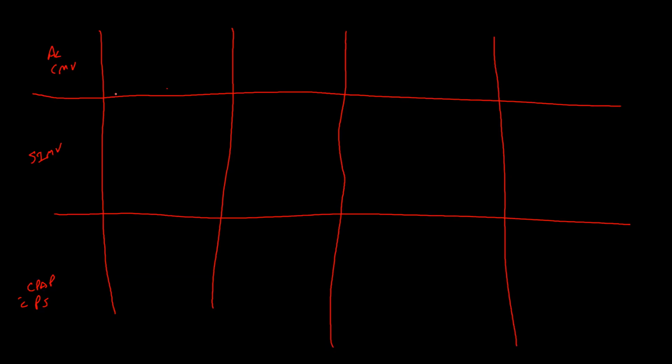So if we have a respiratory rate of 10, that means each window will be 6 seconds long because we just divide 1 minute by 10, and that gives us 6 seconds per window. I talk about the windows because we need to make sure that we have enough time to exhale. It deals with our IE ratio, but it's also good to show you the differences between these when I draw the windows.